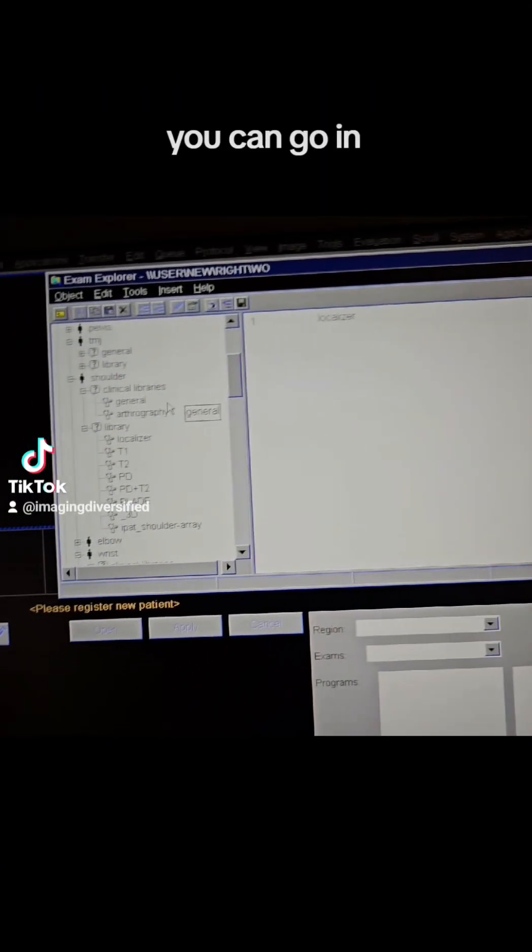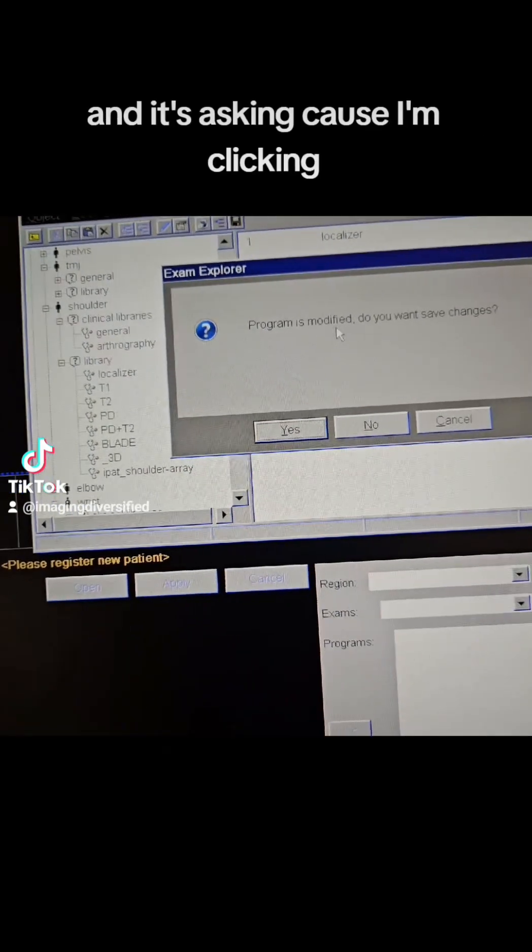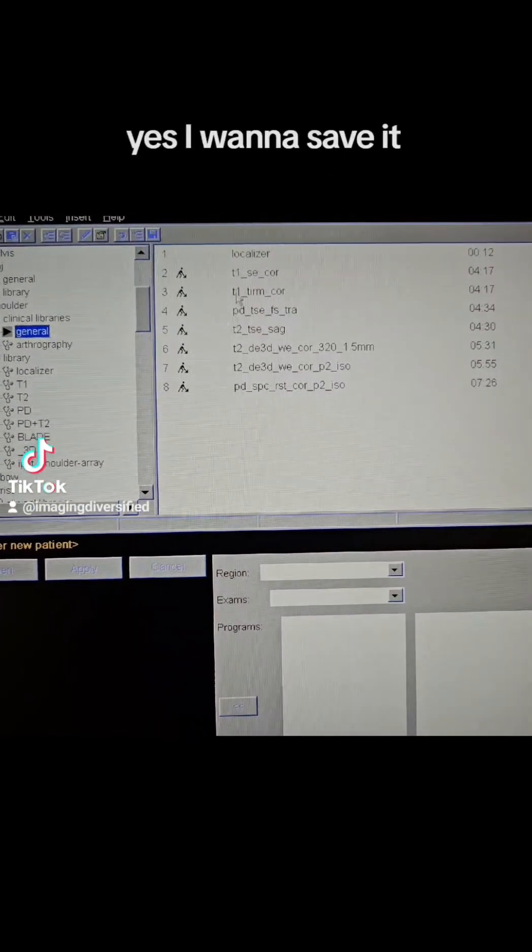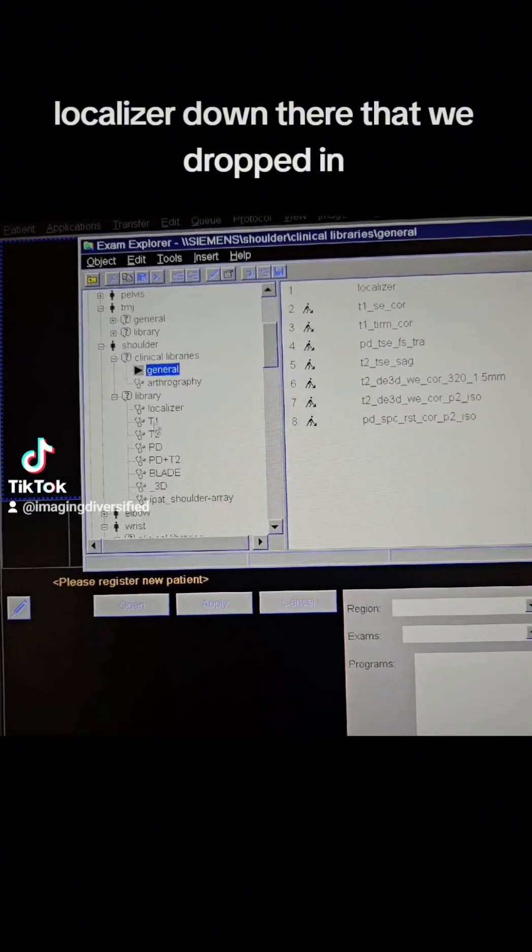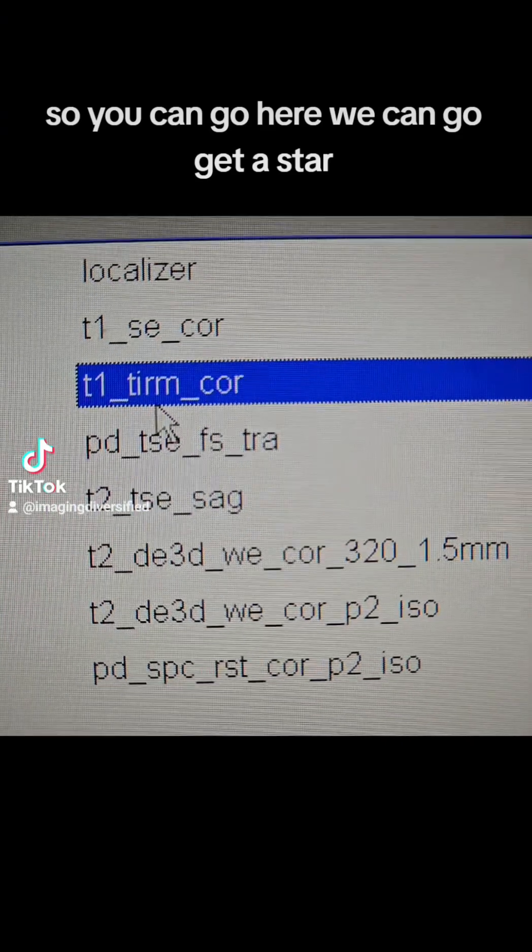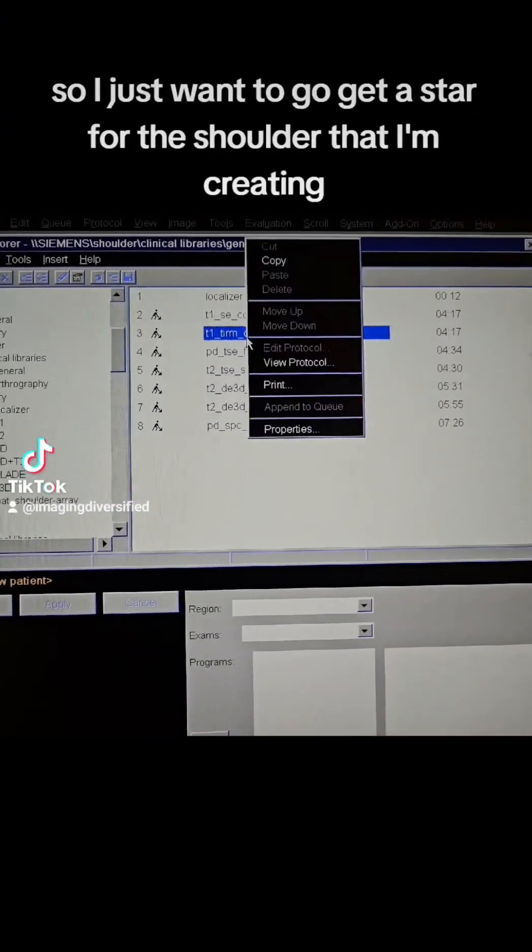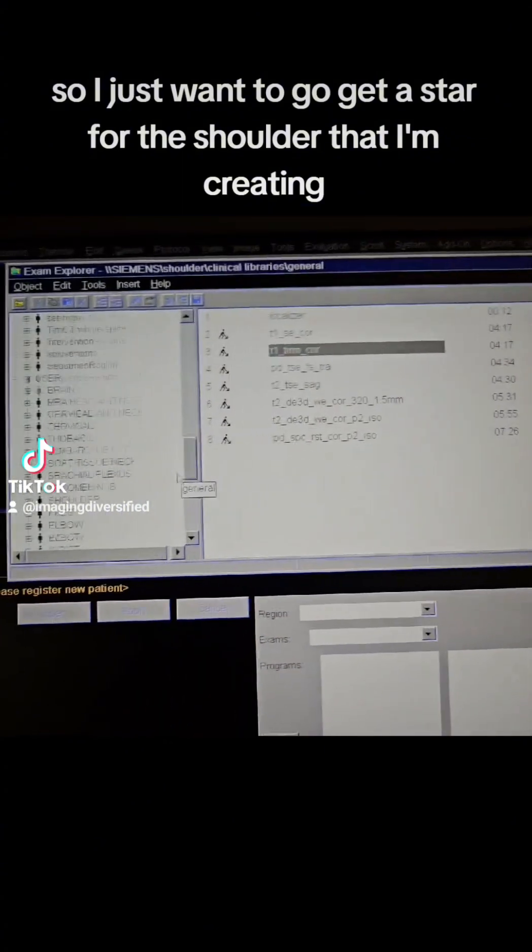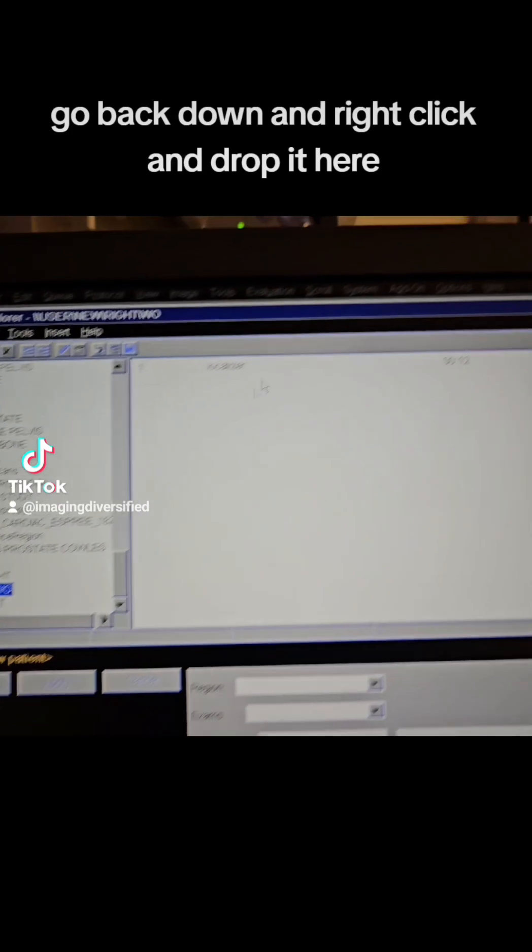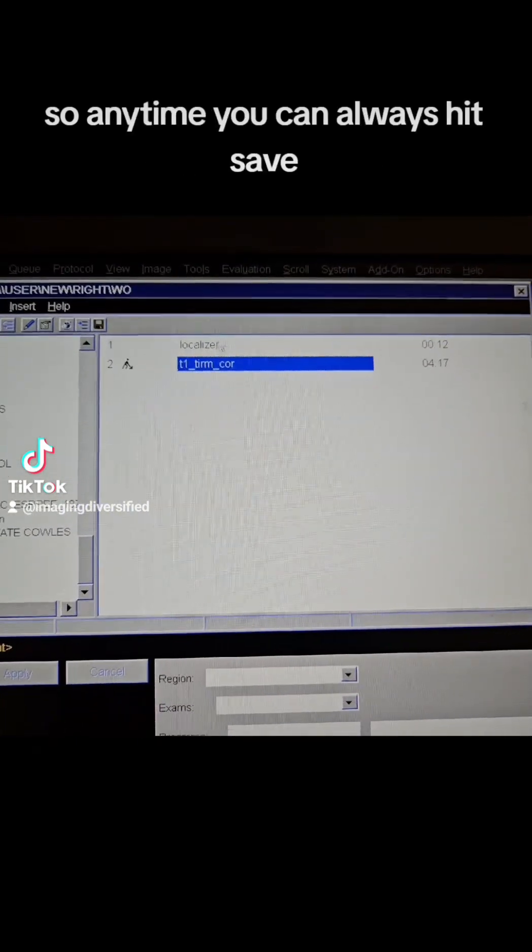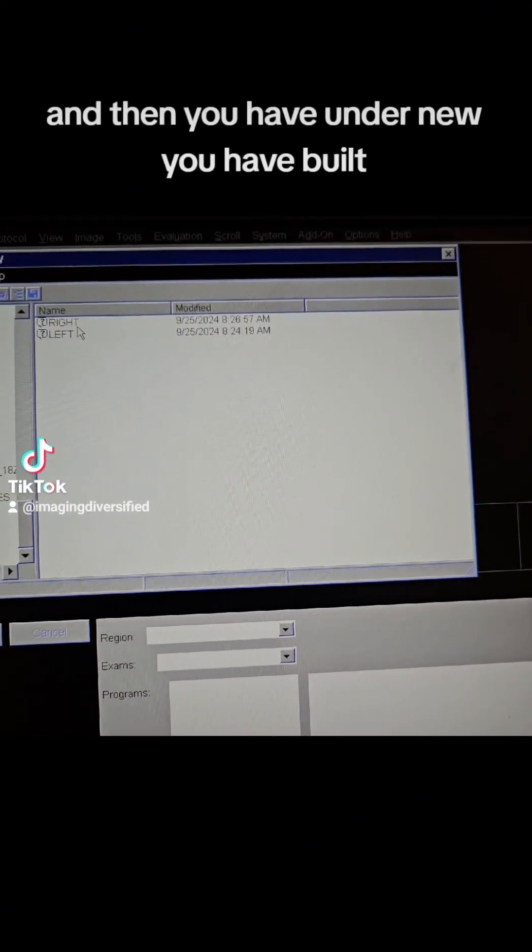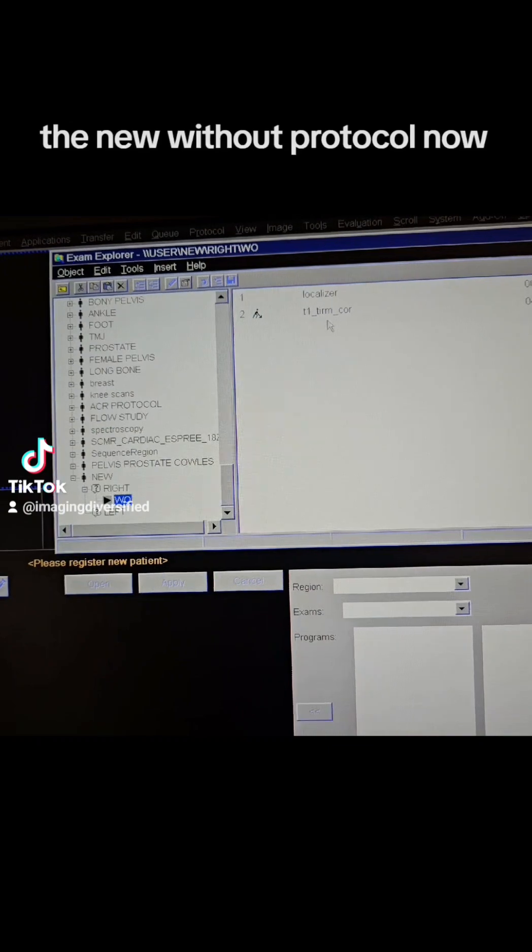You can go in, go back over here. You can drop maybe, and it's asking because I'm clicking, my program is modified. Do I want to save it? Yes. I want to save that localizer down there that we dropped in, so we can go here. We can go get a stir, and you notice the stir goes over to I and the R for inversion recovery. So that's how I just want to go get a stir for the shoulder that I'm creating. Go back down, and then right-click and drop it here. So anytime, you can always hit save, and then you have under new, you have built a new without protocol.